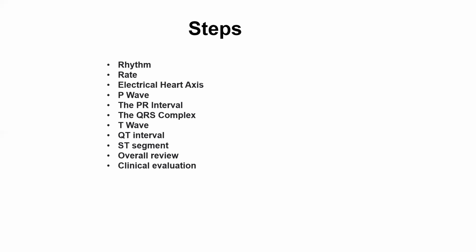Even if the EKG shows some abnormality, probably there's no clinical significance, or even if the EKG is negative and you cannot see anything significant, sometimes there is clinical significance there. So after interpreting the EKG, you have to relate it to the real conditions of the patient, to see if they correlate with each other. That's the last step, which is very important. You need to keep it in mind.